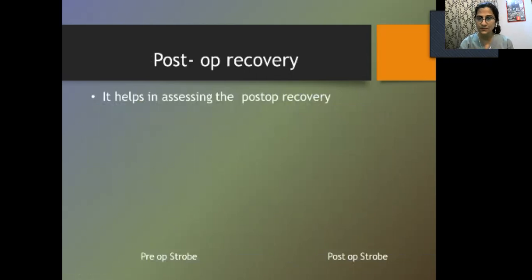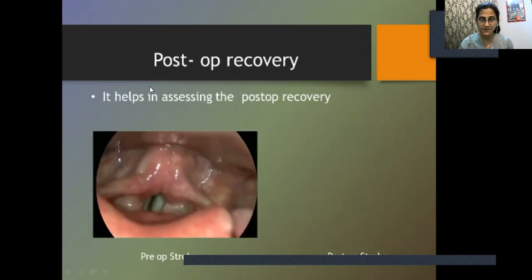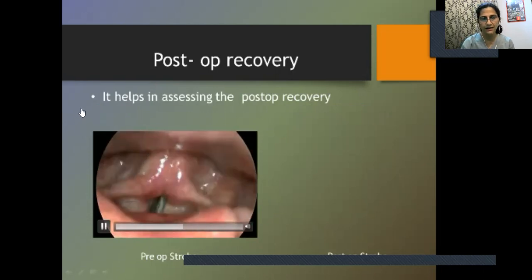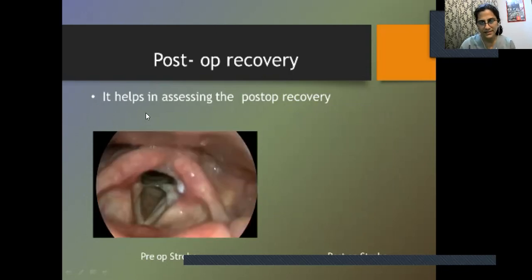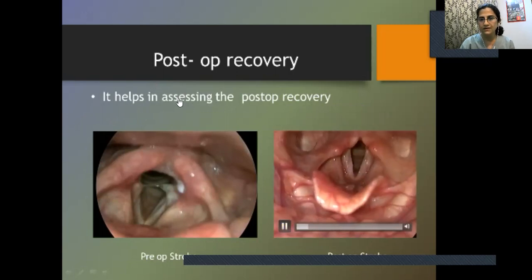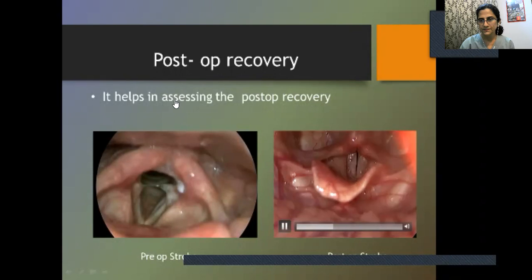It helps in assessing the postoperative recovery. Here we had a case of a very deep sulcus bilaterally with significant phonatory gap and loss of amplitude and vibration of the vocal folds. A Pontes technique was performed on this patient, and you can see that there is a significant return of the mucosal wave formation.